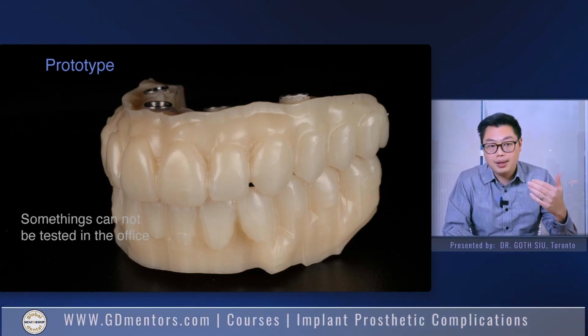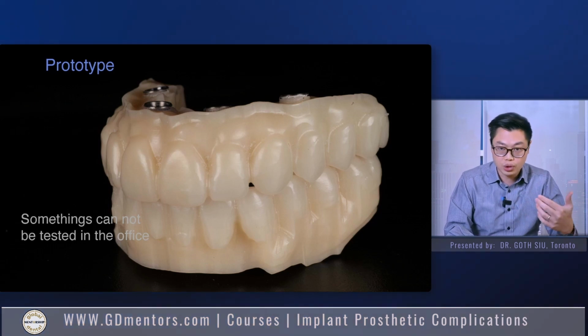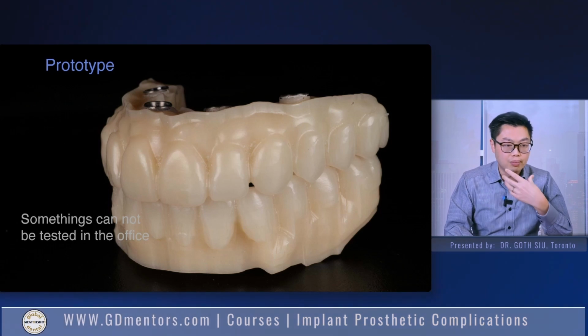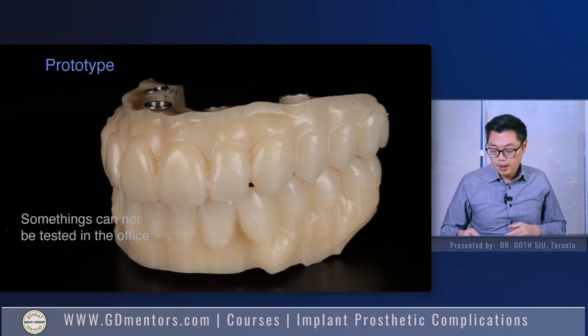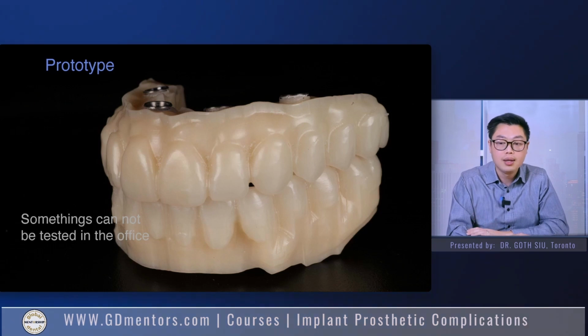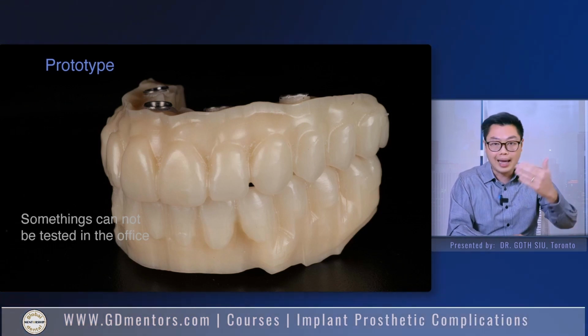I highly recommend doing something like this if the patient has a lot of subjective concerns, like comfort issues: they don't feel comfortable, things feel bulky, I can't keep it clean. You'll get an idea as to who these patients are. Sometimes, even though we did a wax try-in, there are a lot of things that you can't test out in an hour appointment, right?